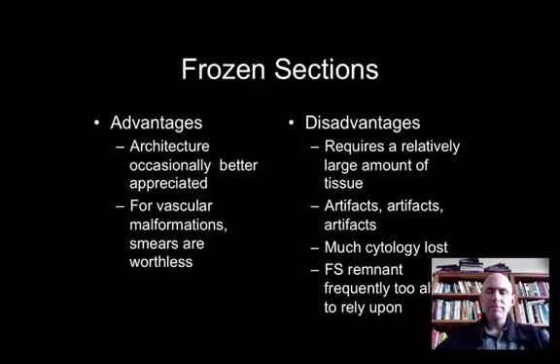And then furthermore, the other frozen section disadvantages are familiar to most people. Oligodendroglial tumors, for instance, tend to look more astrocytic, while the converse is true. Astrocytic neoplasms tend to look more oligodendroglial, ironically. So it's very difficult sometimes. Finally, the frozen section process alters the material, so even our immunohistochemistry doesn't work as well when we've been forced to freeze a sample.